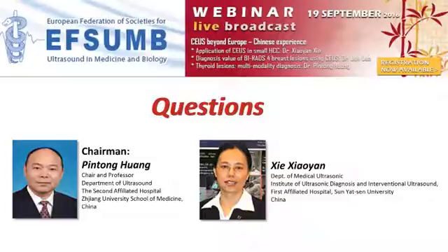After we locate the low enhancement area, we inject the contrast agent again. We take the second contrast ultrasound, so maybe we see the arterial phase enhancement. Okay, thank you.